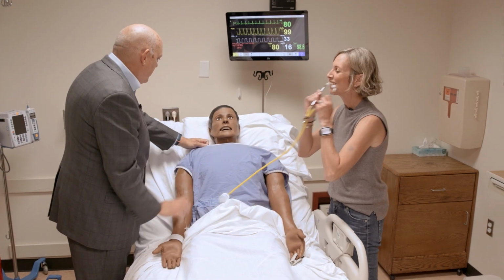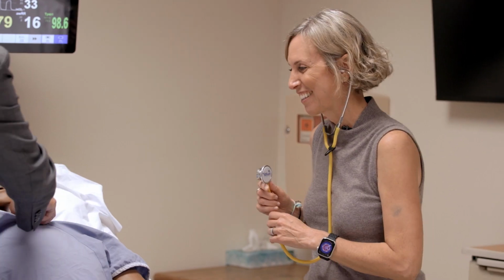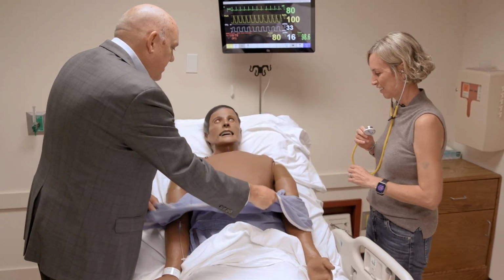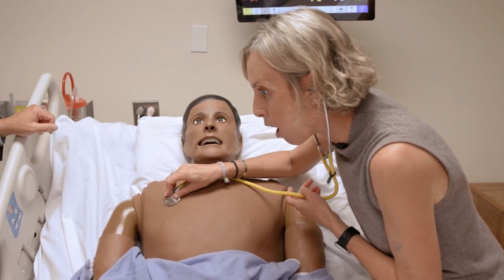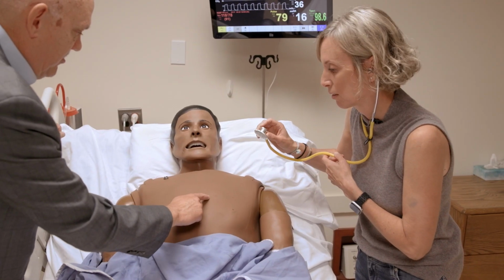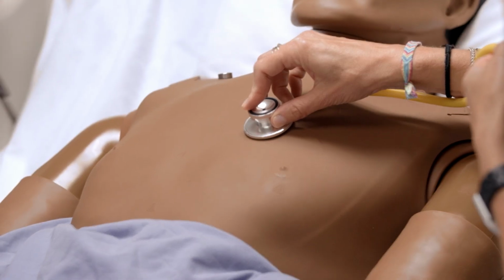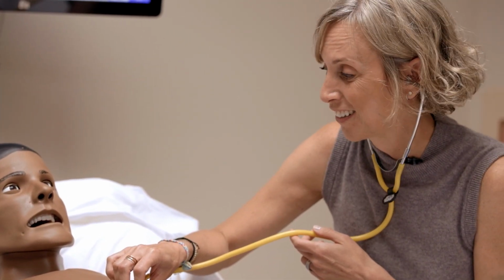So for example, if you wanted to put these in your ears. James, can I pull down your gown to listen to your breath sounds? Simply fine. Okay, excellent. So we interact with the mannequins as if they're real human beings. If you listen here, you'll be able to hear his breathing. Like you can really hear it. And then somewhere toward the center of the chest, right around here, you can hear his heartbeat. That's incredible. It's an actual heartbeat. Everything can be changed. For example, if he's having a heart attack, he changes a thing in the control room, and the type and quality of his heartbeat changes.